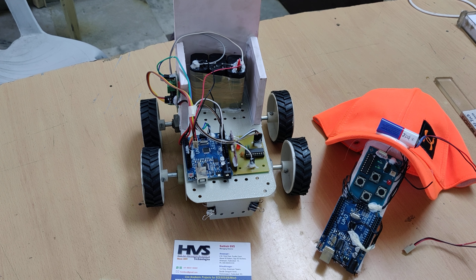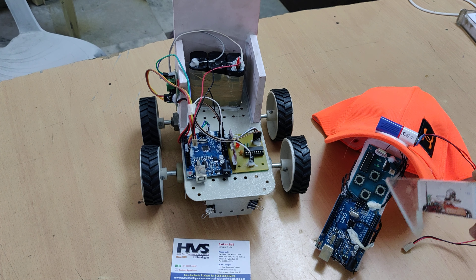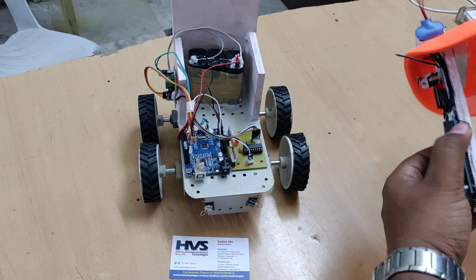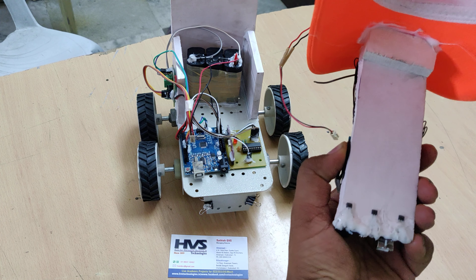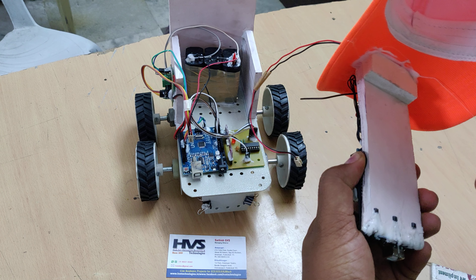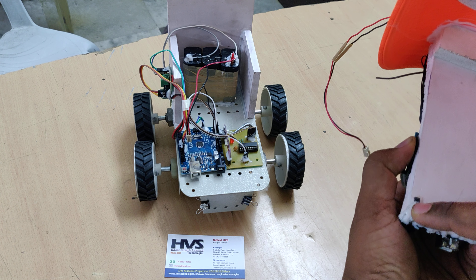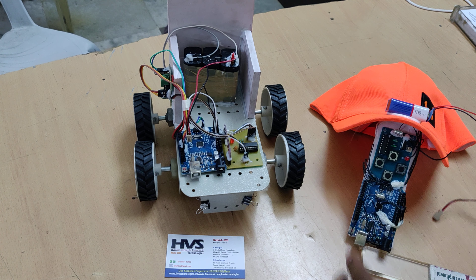Here we are demonstrating tongue control wireless wheelchair using Arduino UNO. We have interfaced an RF encoder along with a transmitter to the Arduino UNO board. This consists of three Hall effect sensors used to detect magnetic field. The main purpose is to place a magnet on the tip of the tongue — when shown to the sensor, the wheelchair moves forward, left, or right.